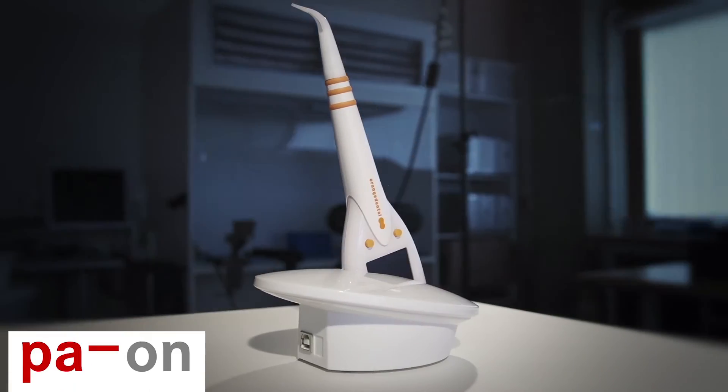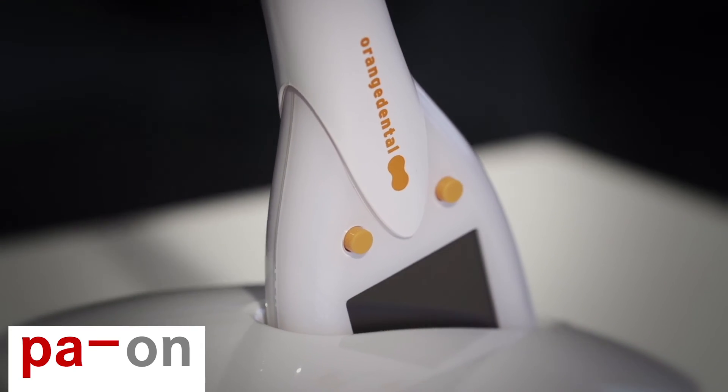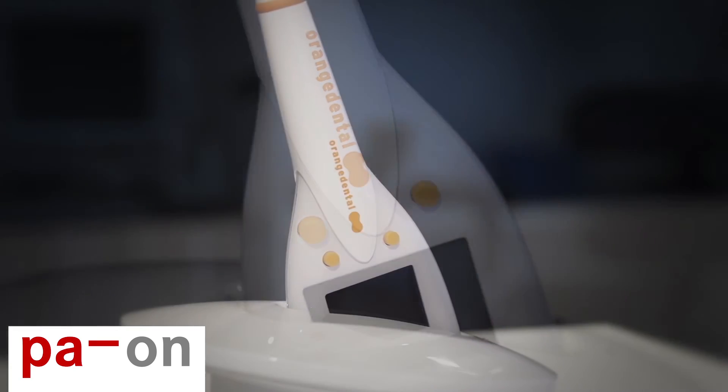In addition, it's possible to transfer the data directly to the accounting software. So, what are you waiting for? Periodontal status made easy — a solution by Orange Dental. Simply Periodtastic.